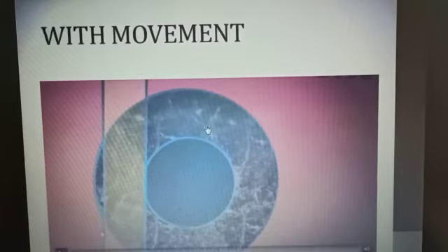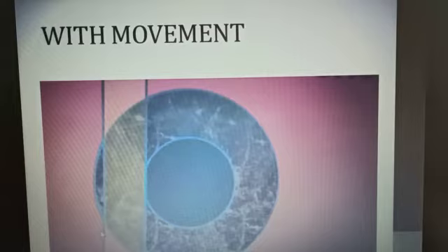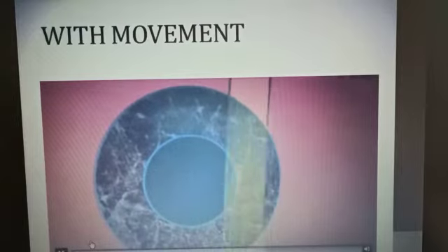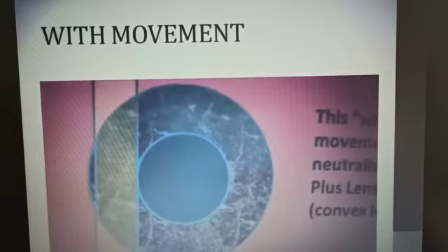This is the with-movement reflex. You will find with-movement reflex when the patient is highly hyperopic. To neutralize this type of movement, you have to use plus lenses or convex lenses. Here you can see the reflex is moving along with the retinoscopic beam — they are both moving in the same direction.